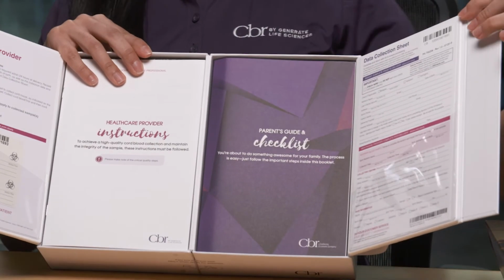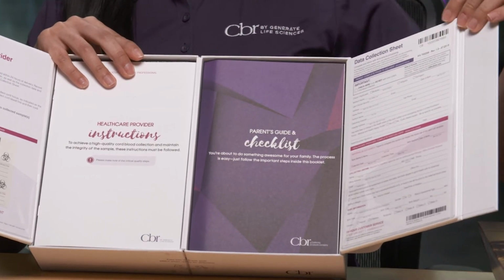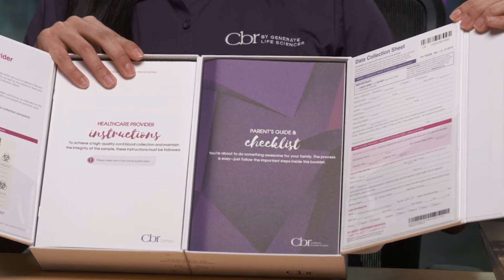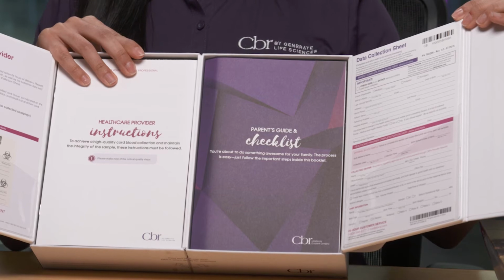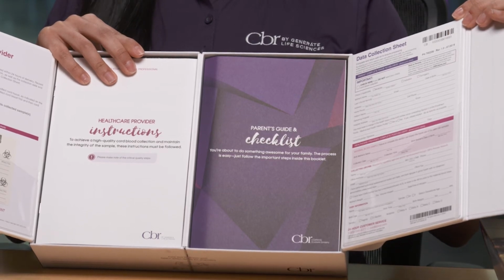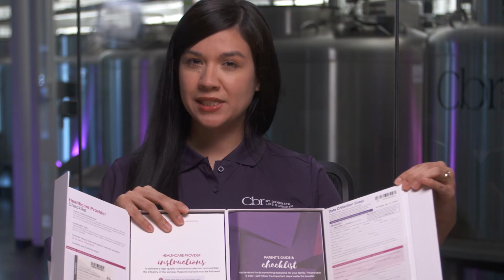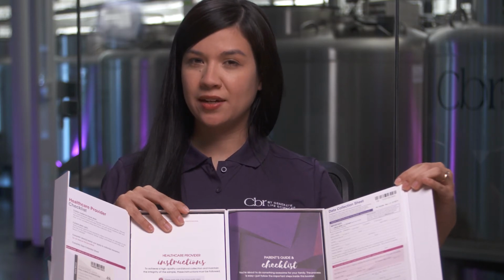You'll find the data collection sheet. The top section needs to be filled out and signed. If you've opted to save your cord tissue, it is crucial that you follow the instructions provided on this data collection sheet and fill it out accordingly. This is crucial information for our laboratory to receive upon arrival with your collection kit.